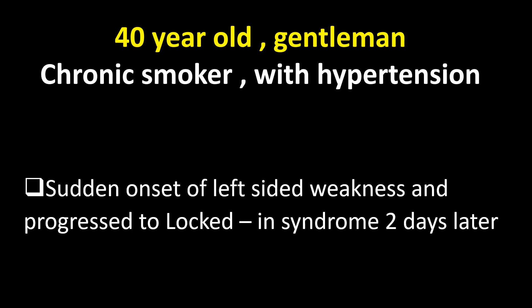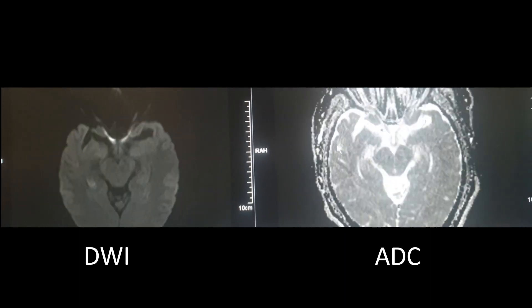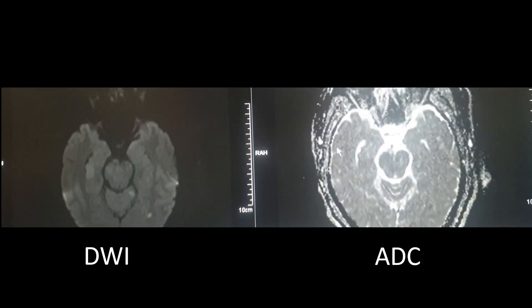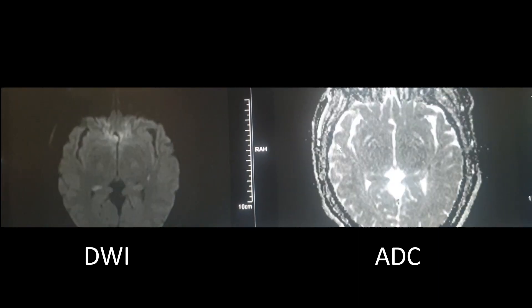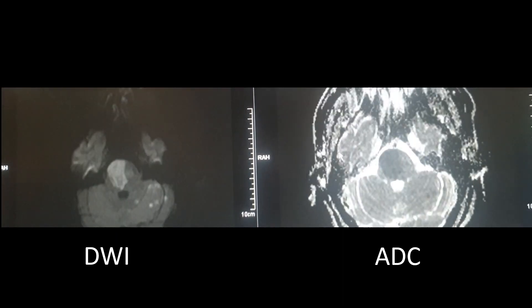Now let us practice with this case: a 40-year-old gentleman, a chronic smoker with hypertension, who presented with a sudden onset of left-sided weakness and progressed to locked-in syndrome two days later. Here is the DWI sequence on the left and the ADC map on the right. There are DWI hyperintensities with corresponding ADC restriction suggesting acute infarcts over the right hemipons extending to the left ventral pons. There are also signals in the right and left cerebellar hemispheres, more on the left, and in the left lateral thalamus and left inferior temporal region — all within the posterior circulation territory.